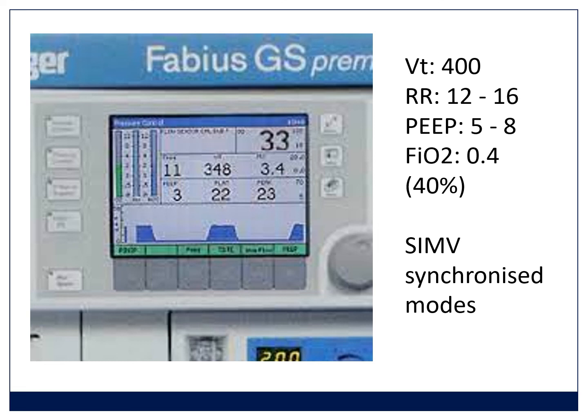But if the ventilator is not working, go back to your manual ventilation, and then afterwards work out whether there's a problem, whether it's you or the machine. And if you've never used the ventilator on your machine, you should practice doing this before you do a GA. Attach the circuit to a false lung, which is just a bag. Let it ventilate that bag and practice setting it up so that when you get to this component of the anesthetic, it's easy. And it really is an easy thing if you've done it a few times. And use those settings. They're also in our article that I mentioned at the beginning on the ectopic. And this range will sort out 95% of patients.